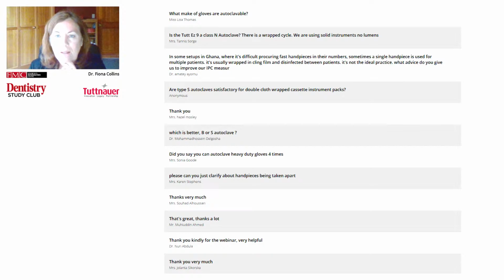Are there any measures you can take in order to make manual cleaning more effective? If you're looking for increased efficacy, it suggests that the device you're trying to clean is one that is not best cleaned through a manual process. There are some where it's indicated that manual cleaning should be performed. Otherwise, the most effective thing to do is to actually use an ultrasonic cleaner or an instrument washer disinfector.